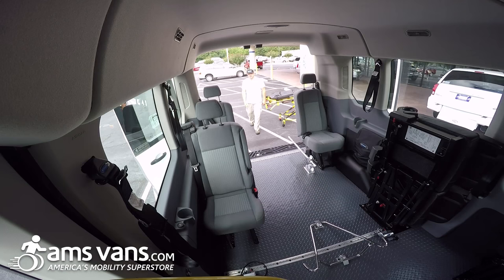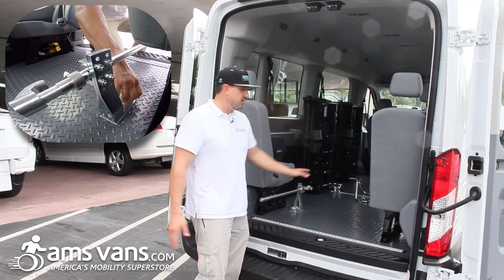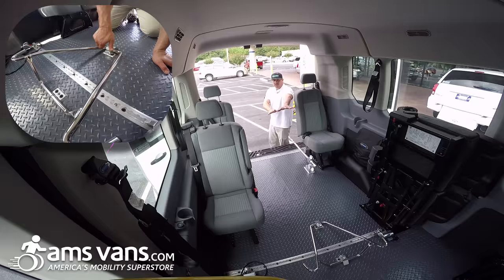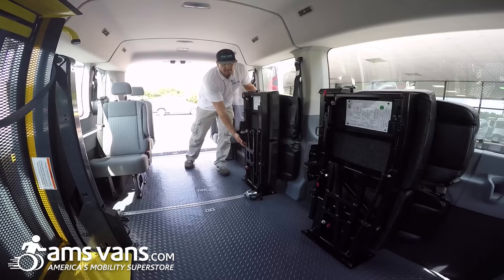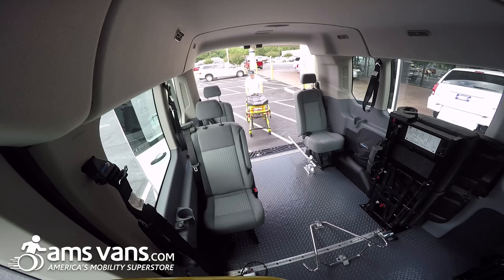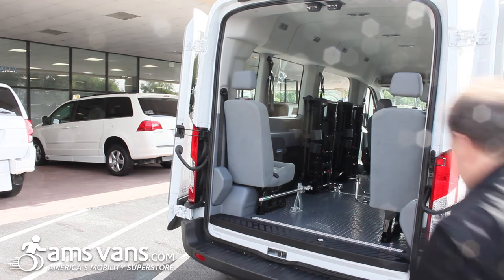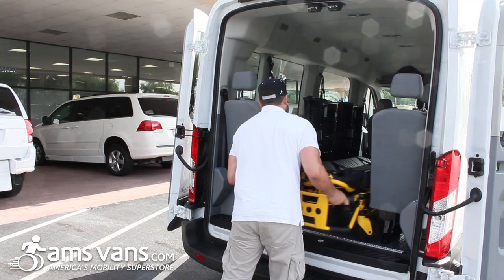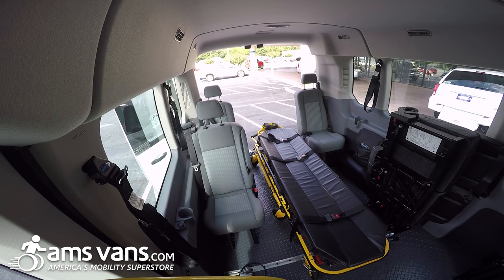This van can actually be used as a gurney application. You can remove the cradle and it could be a two wheelchair passenger van, possibly three. Or it can be a straight passenger van with these two double fold jump seats. Usually you'll have two people on a gurney app — Brian's going to help load it in. This goes into the cradles, locking in place, and then you're good to go.